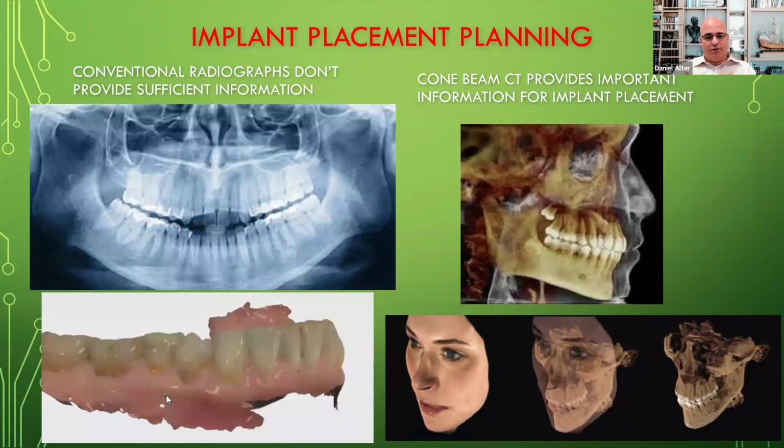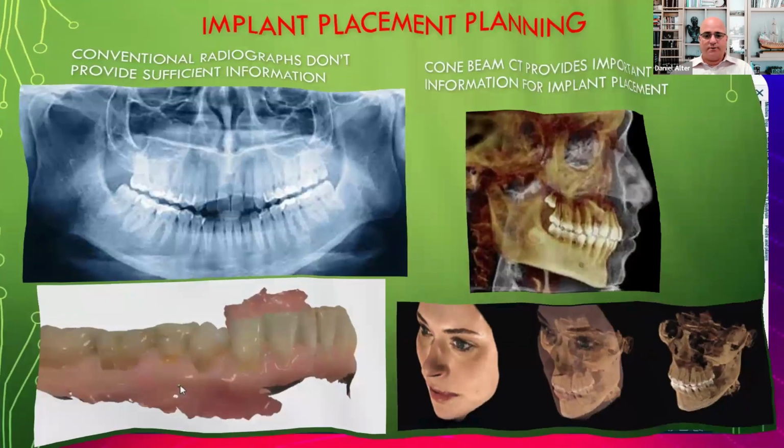And then having this software where it shows them what it would look like, so they're almost seeing two snapshots of before and after, before anything is even done. It's an incredible patient acceptance opportunity that really allows us to grow in a big way.